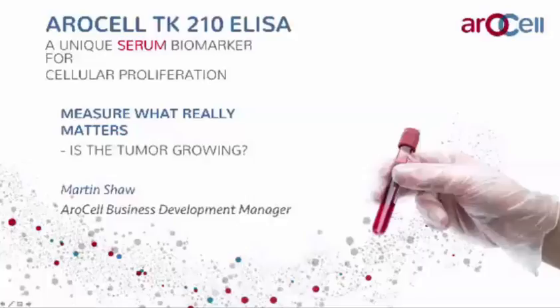Can tumor proliferation be identified at metastatic sites by this assay in the absence of tissue from the primary site? Well, I can take this one, and yes, you can use it to study the proliferation in metastatic sites. That is, if you have removed the primary tumor, if the TK level is still high or maintaining at an increased level, this is a clear-cut sign of a metastatic process where there is cell proliferation going on at other sites. In order to localize it, of course, you need other methods like imaging.